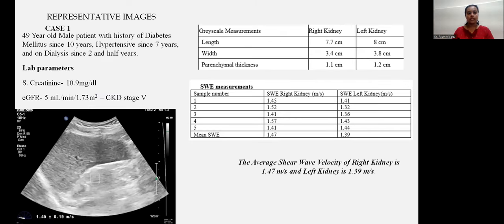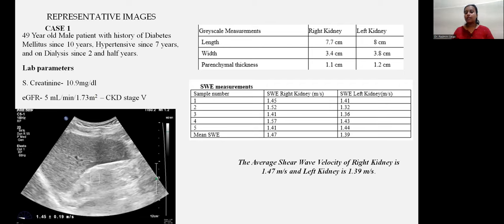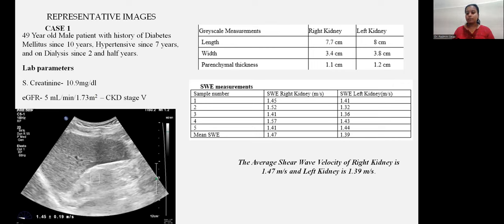Moving on to the cases. Representative image: a 49-year-old male with a history of diabetes mellitus for 10 years, hypertension for 7 years, and on dialysis for 2.5 years. Serum creatinine 10.9 mg/dL, eGFR 5 ml/min/1.73 m², CKD stage 5. Right kidney: length 7.7 cm, width 3.4 cm, parenchymal thickness 1.1 cm. Left kidney: length 8 cm, width 3.8 cm, parenchymal thickness 1.2 cm. Mean shear wave velocity was 1.47 m/s in the right kidney and 1.39 m/s in the left.